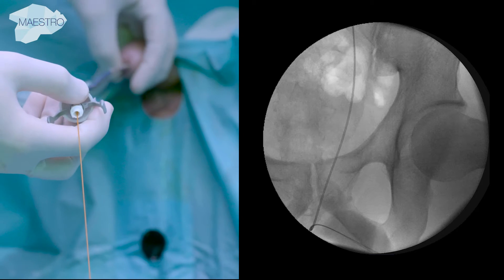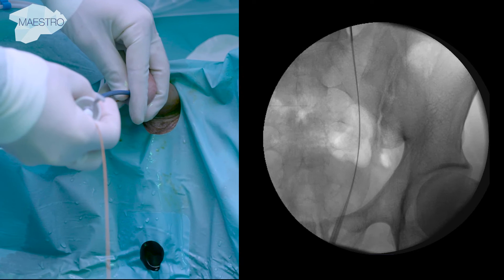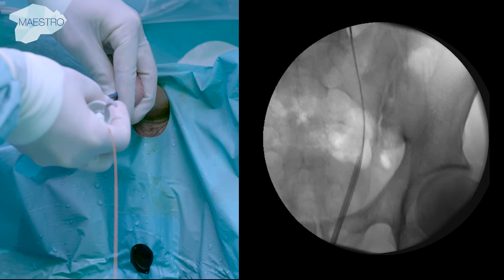An atraumatic tip guides the sheath safely up the ureter, while a radiopaque marker ensures accurate and precise positioning of the sheath.